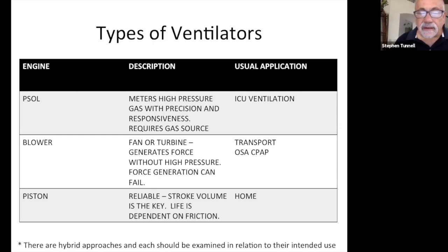and that's a tremendous advantage, and where it's become popular is that blower ventilators have found their way initially into transport. They originally came from obstructive sleep apnea and CPAP. That's where we first started using blowers, but blower technology has improved over the last 10 years, and mechanical ventilators are now employing blowers as their source of air.